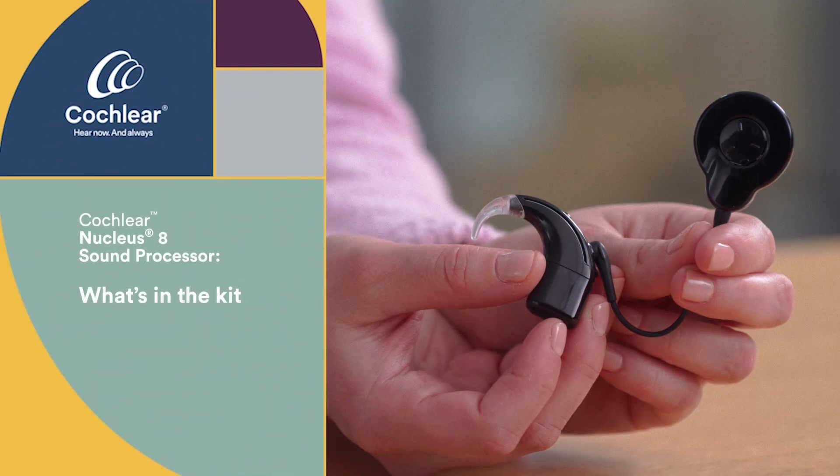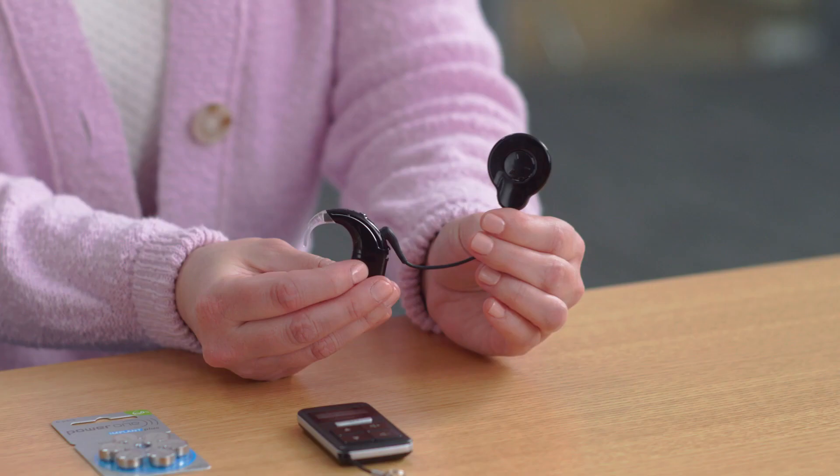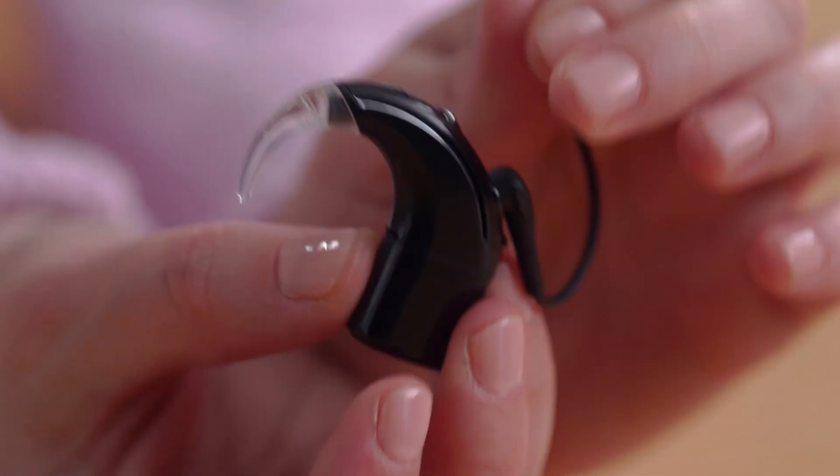Let's start with the Cochlear Nucleus 8 Sound Processor. It comes in six different colors, including the additional silver option. The Nucleus 8 is designed to be the smallest, lightest, and smartest behind-the-ear sound processor. The core components of the Nucleus 8 are the processing unit, the control button, the coil, the magnet, the battery, and the ear hook.